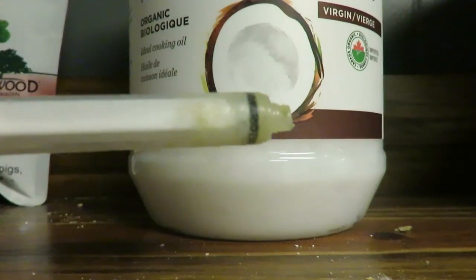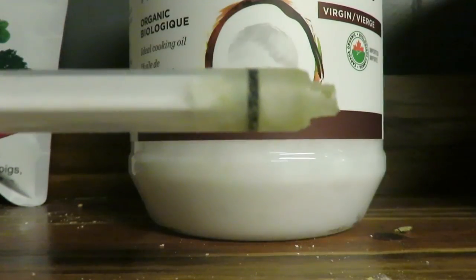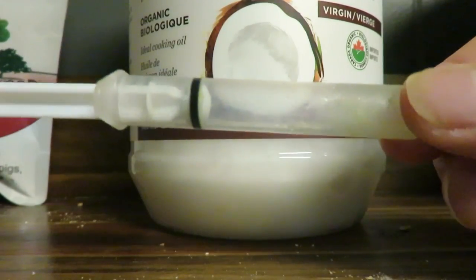I only do this for my hand feeding syringes. You wouldn't want to do this for medication syringes — throw those out and get a new one. But for hand feeding, coconut oil is perfectly safe and is not going to interact with the food you're feeding.